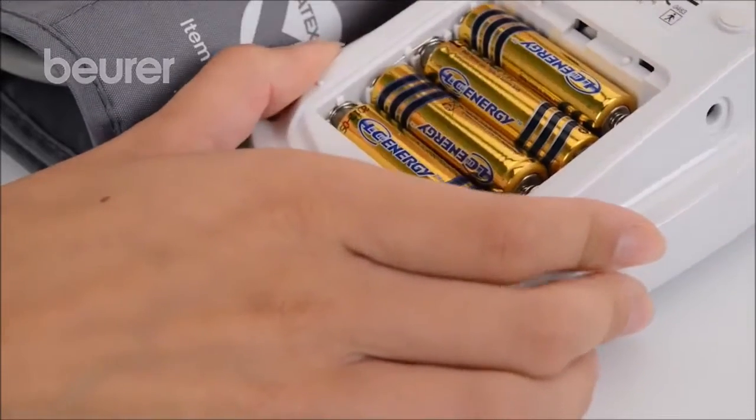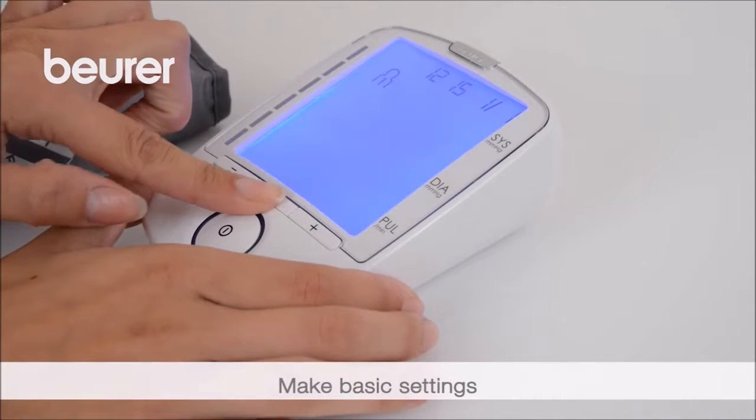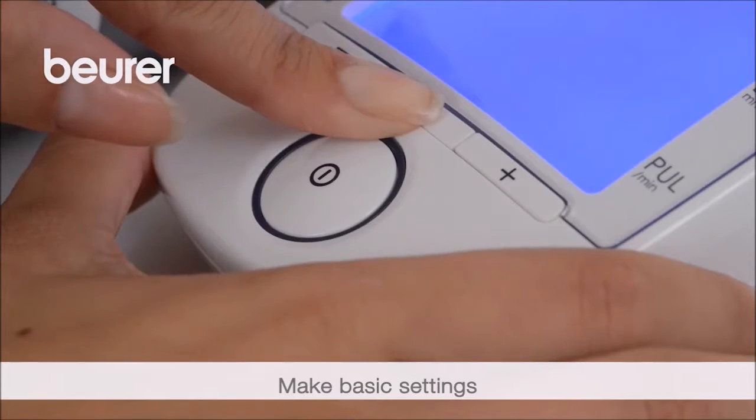Insert the batteries. Set the date and time. To do so, press the memory button M for at least 3 seconds.